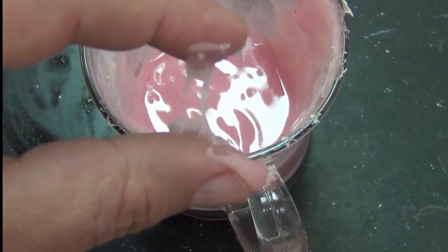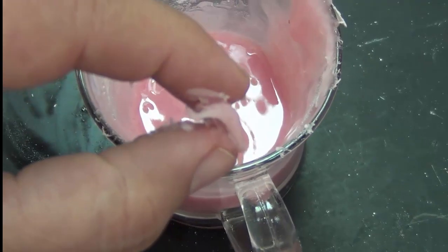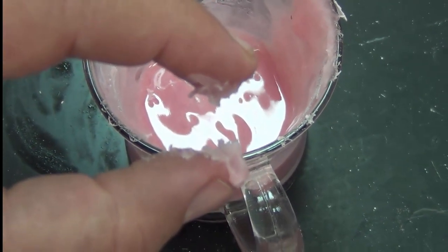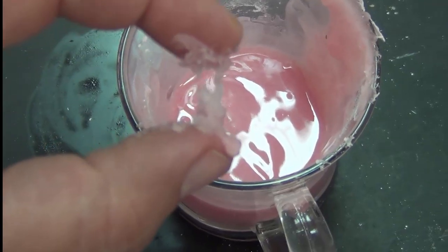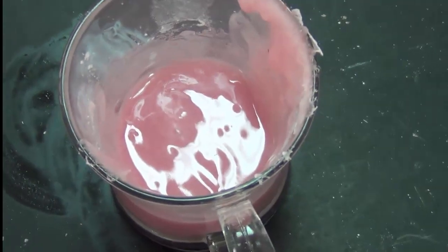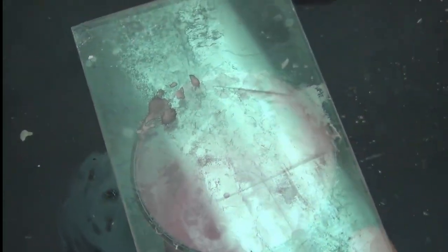It occurs describing this, what you see. When you separate it, it separates itself in strings. The reason is partial dissolution of the powder. In this case, the monomer had not penetrated into the center or the core of the powders yet, so it's in the stringy stage. When the monomer penetrates into the center of the powder, so we're going to go back and cover it.